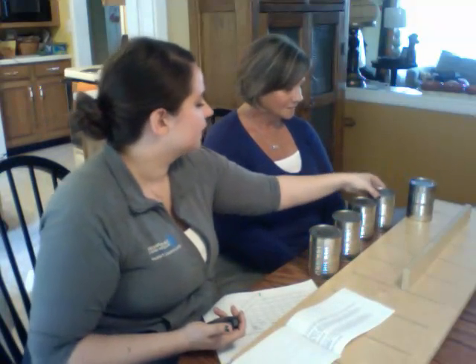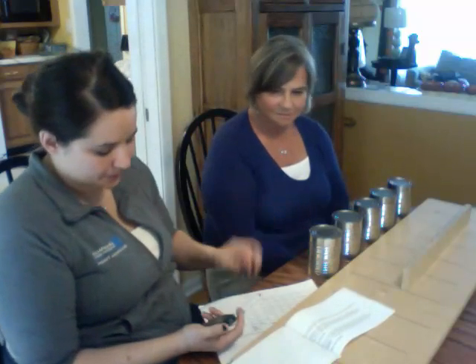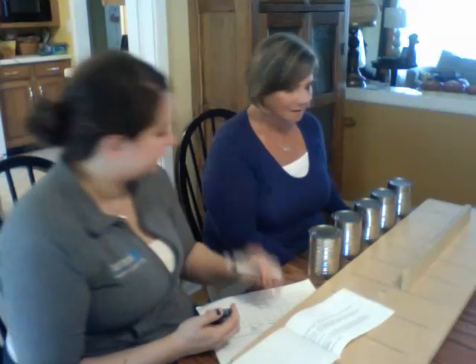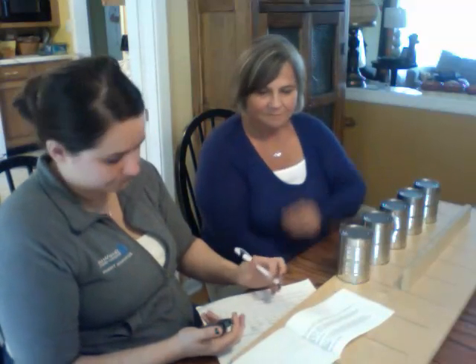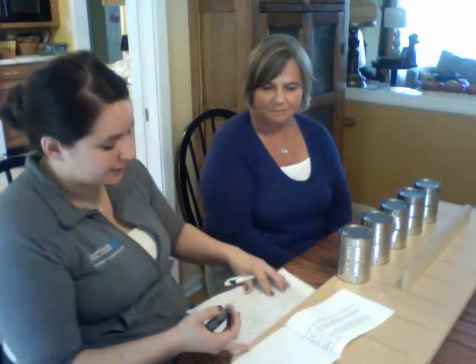All right, now we're going to do the same thing with your dominant hand. So you see, on all of these tests, we switch from your non-dominant to your dominant. All right. And you're going to begin on that side again. All right, very good. All right, ready? Go. Very good. All right, so that concludes our assessment.